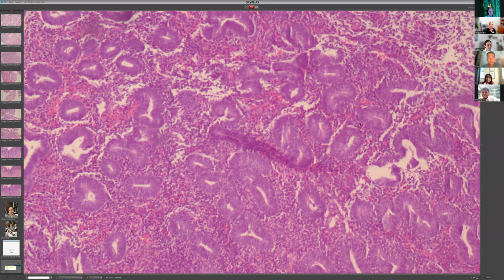You mean that we will see the stroma between two glands? If there is less stroma there, that would be crowded. So yes, gland to stromal ratio, it's 1:1. That's what the textbooks usually say.